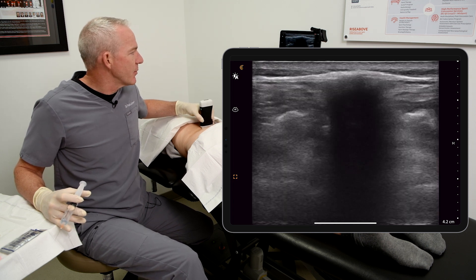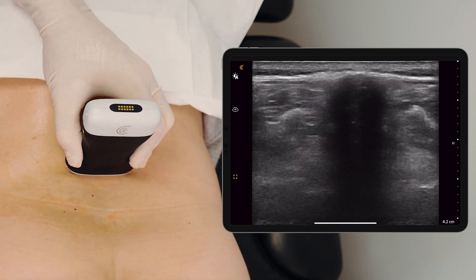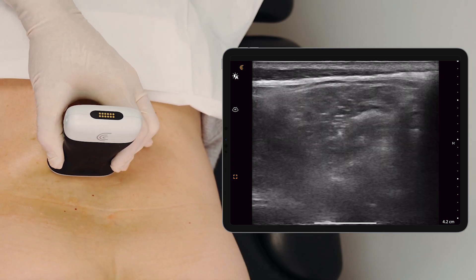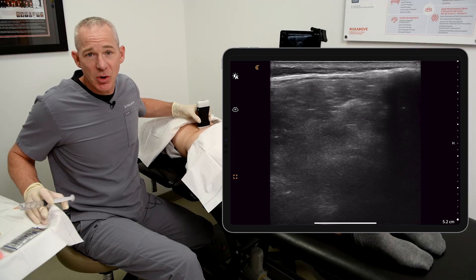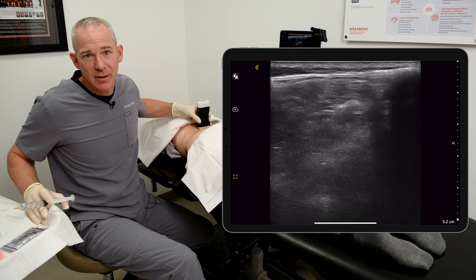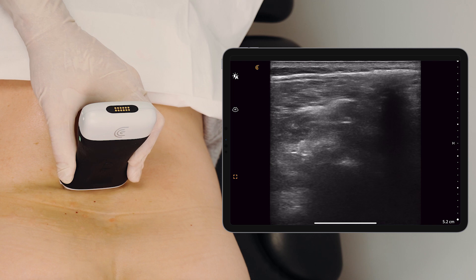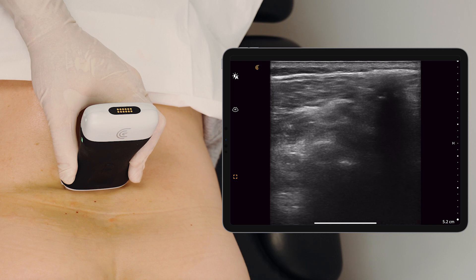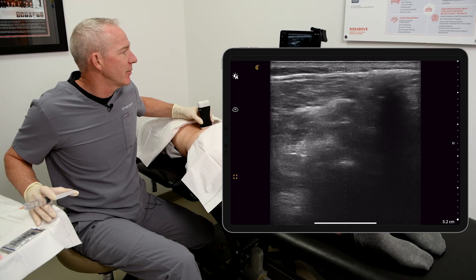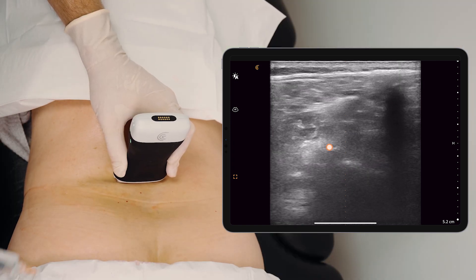What we find here is the spinous process in the center. We slide laterally, and we know that the facet joint injection will be halfway between the transverse process and the spinous process. Here we see a very good view of both the superior articular process and the inferior articular process. Center guide. Increase gain.